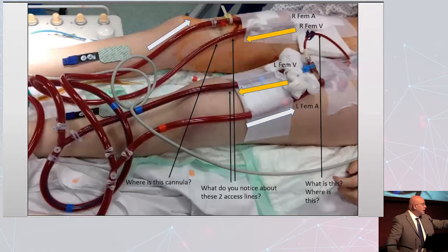Okay, it's not two at a time. So whoever spoke first, stand up, say what you've got to say. It's a reperfusion catheter in the superior femoral artery. SFA, superficial femoral artery. Very good. Okay, you won that round. Don't let me forget. Okay, now, next question. Just blurt it out if you want.